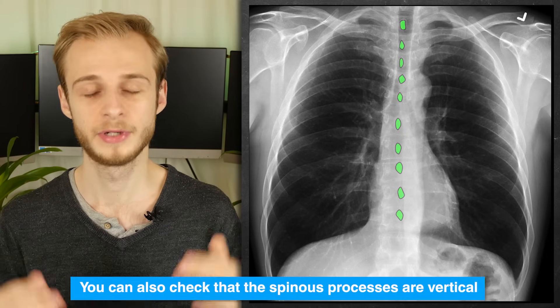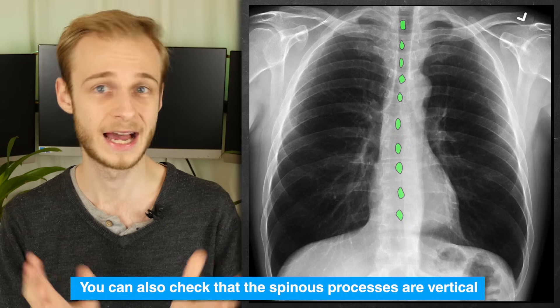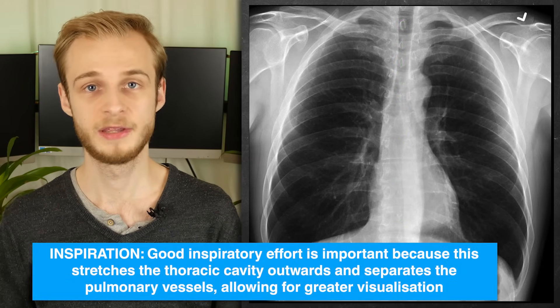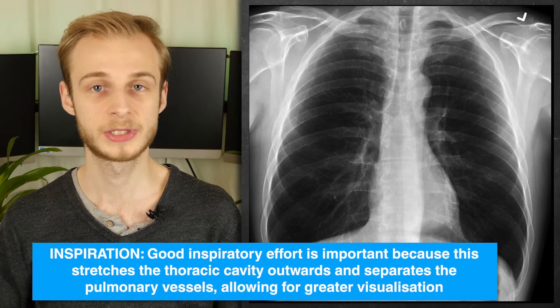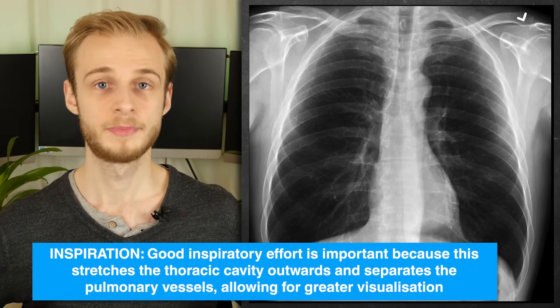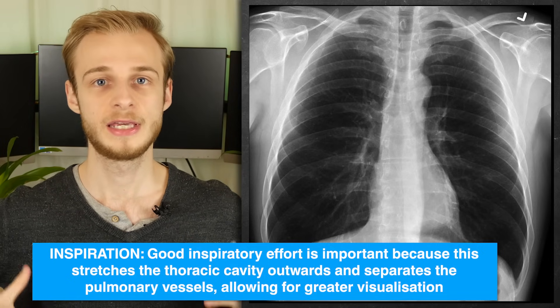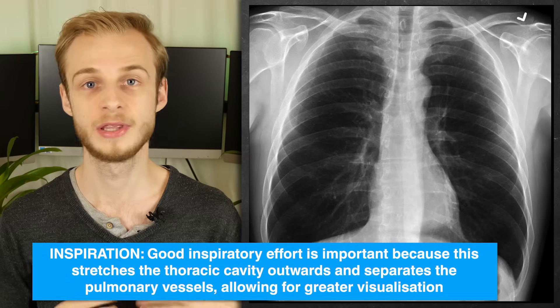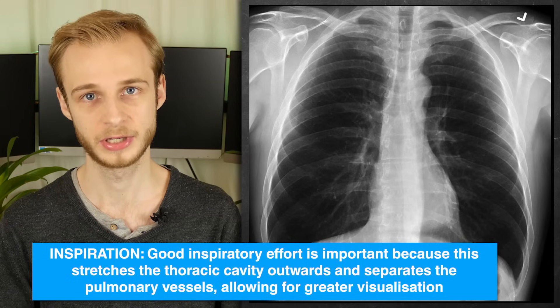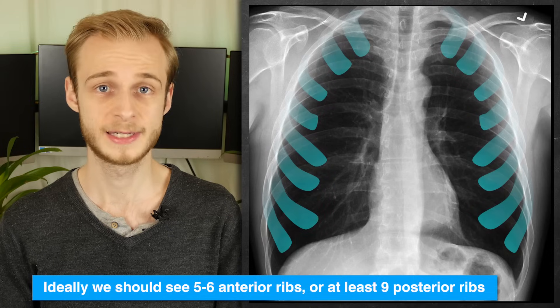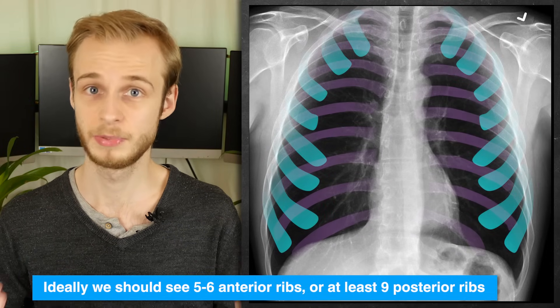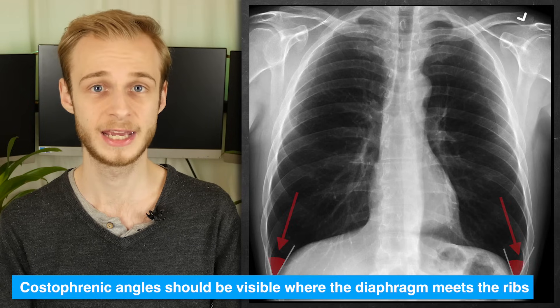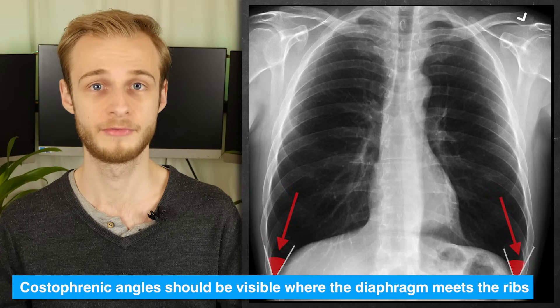In this case it's not perfect, but you are looking for something grossly abnormal to know that something is wrong. I is for inspiration — how well did the patient breathe in when they were asked to? When we inspire, this stretches the thoracic cavity outwards, which separates all the vessels and soft tissues we might want to look at. On an ideal x-ray we should see at least five to six anterior ribs or nine posterior ribs, the lateral edges of each rib, and the costophrenic angle where the diaphragm meets the ribs at the bottom.